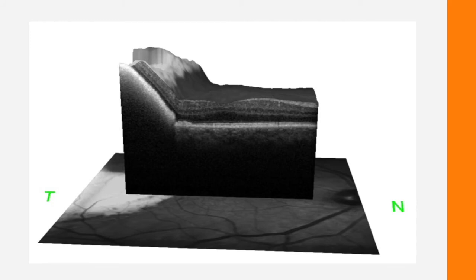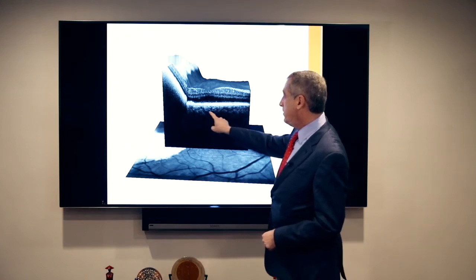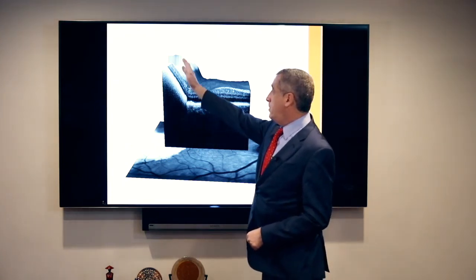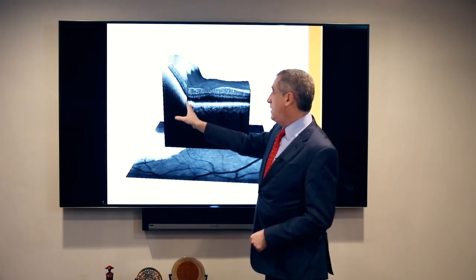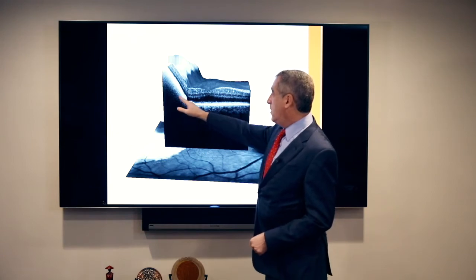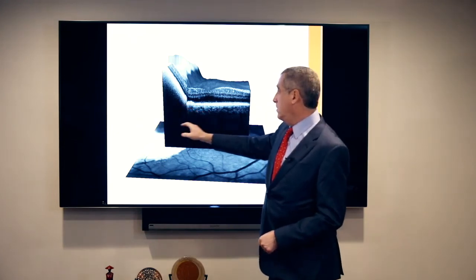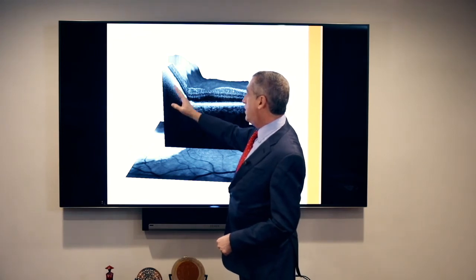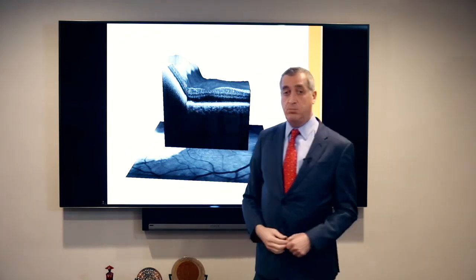This is a higher magnification image of the same. You look at the choroid here, it looks normal. There's no tumor in it. And then all of a sudden, boom, you hit the tumor and you're up. And the tumor is not from the choroid necessarily, or it could be way down yonder. But at least here, it's subretinal material, which in this case is blood.